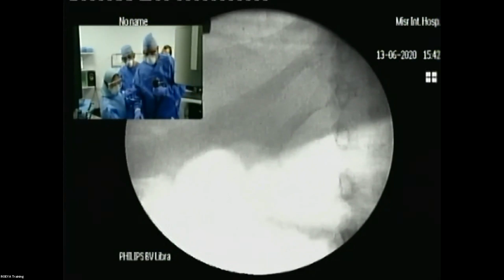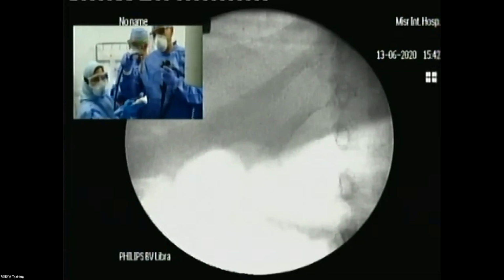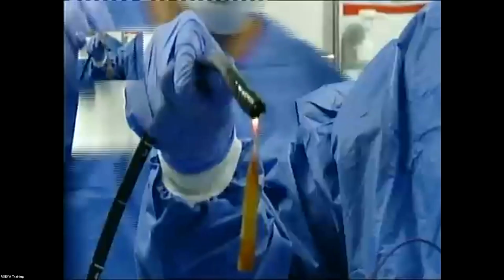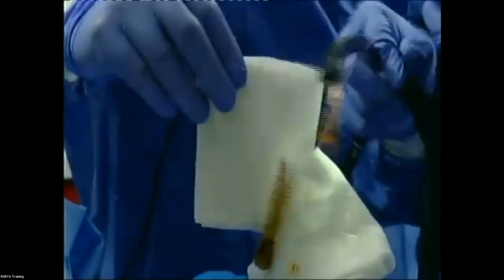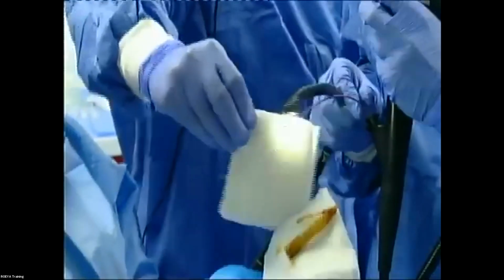Now I'm not sure if you can see our image now. So this is the stent. Could you show the camera? Come nearer, more. Put the stent on your gown. I'll just put it out. Can you see it now? Yes, it's clear. It's a good job. Excellent.